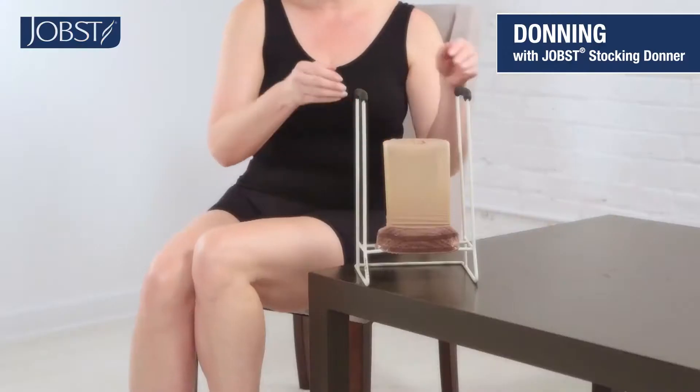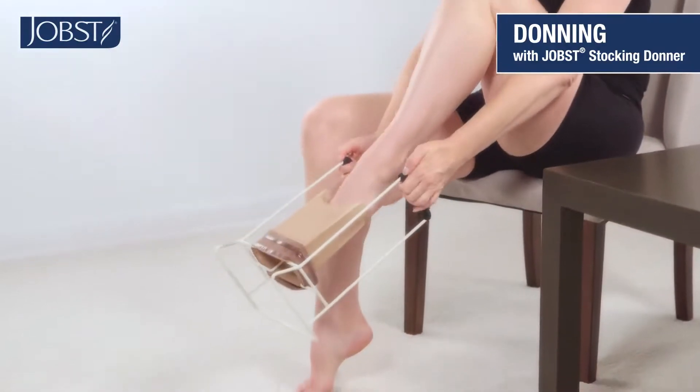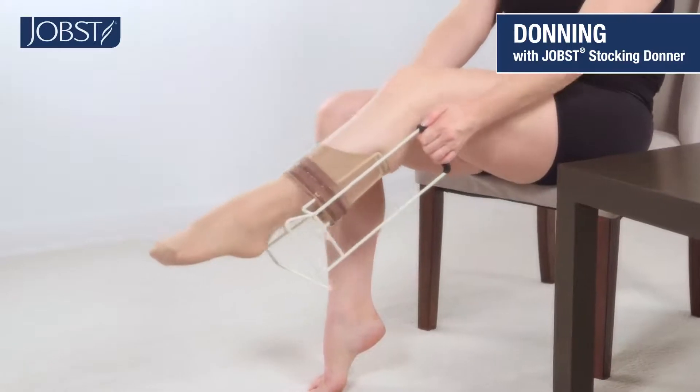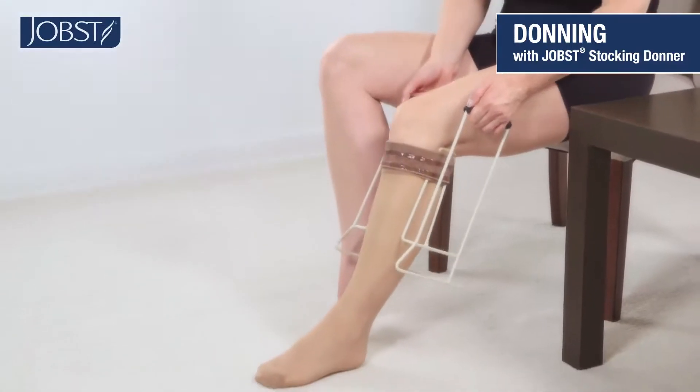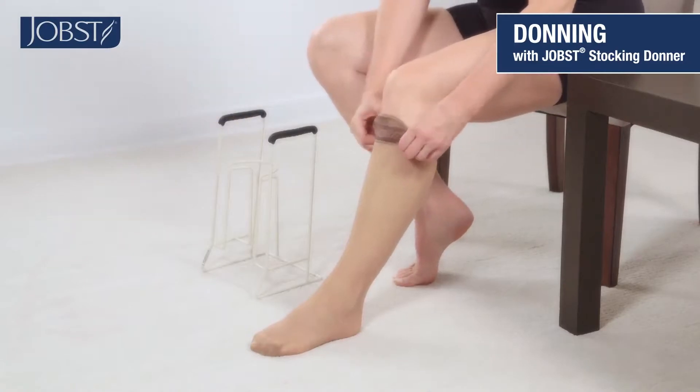Now take the stocking Donner and point your toe down through it until your foot is completely down to the floor. Continue to pull up on the Donner until the stocking is above the calf. Then pull the stocking Donner backward and down, freeing the stocking.